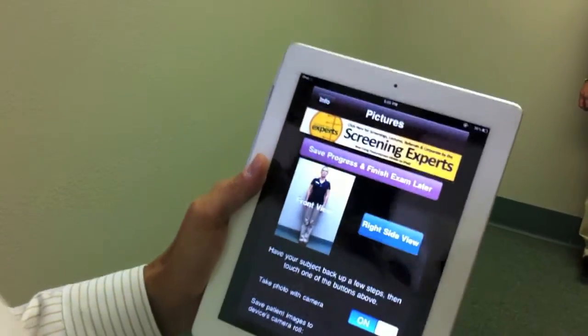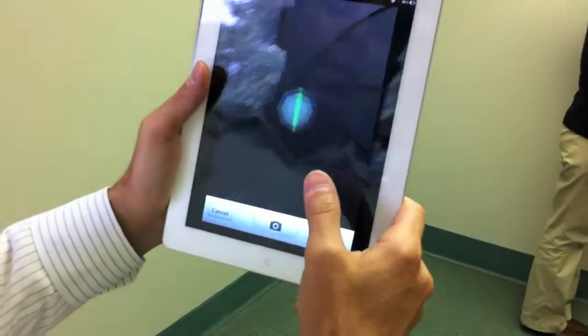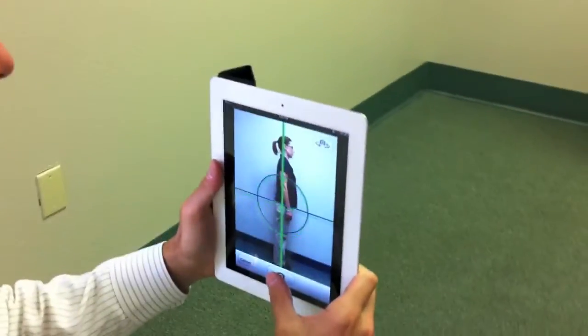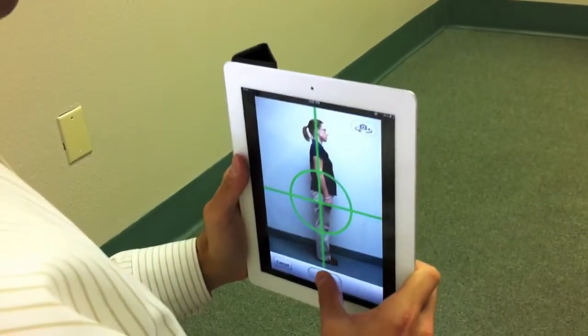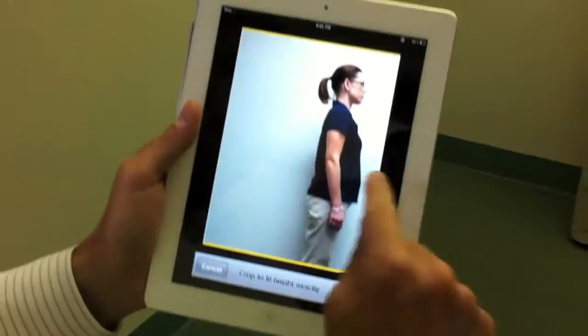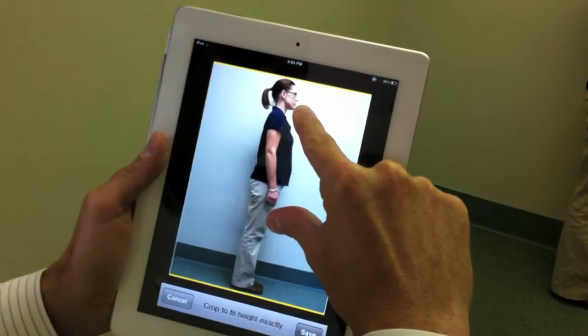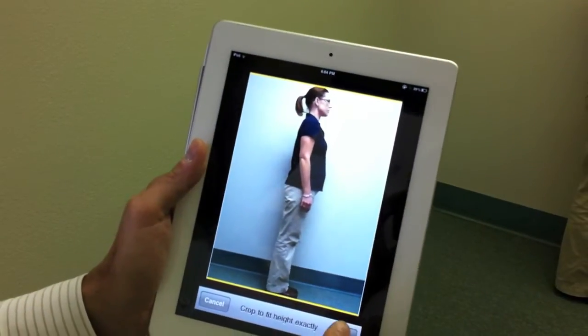Now we're going to do the side view. So I'm going to ask Nicole to go ahead and face that way to the right side. We're going to do the right side. She's going to stay in neutral posture. I'm going to again get on my knee — that way we get the best posture evaluation that you can get. I'm going to get down low, then hit use, and we're going to make sure the top of the head and the bottom of the feet are right in there. That is the most important step that you can do. Hit save.